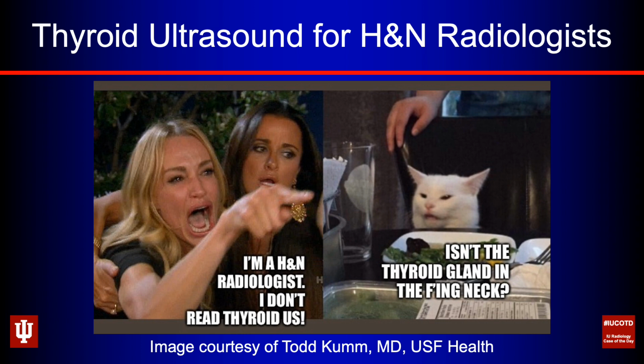And so I'm going to do just a quick overview of some of the high points of thyroid ultrasound. I'm certainly not an expert. I'm not pretending to be able to make anybody an expert on thyroid ultrasound during this brief talk, but there are some important points that I think head and neck imagers need to be aware of.